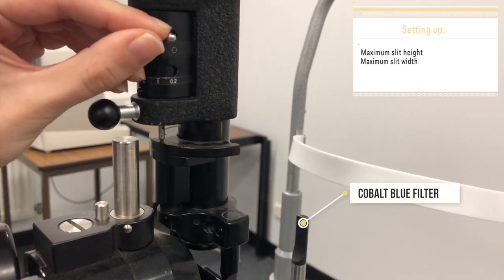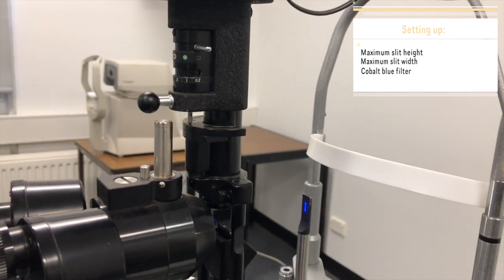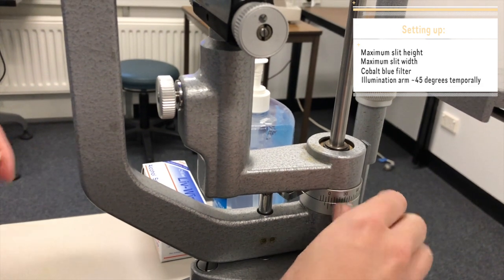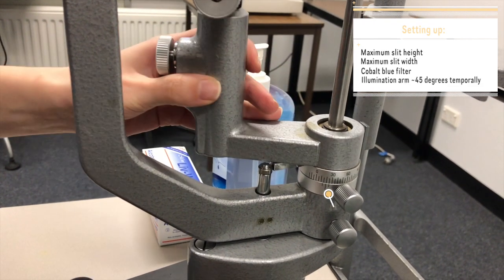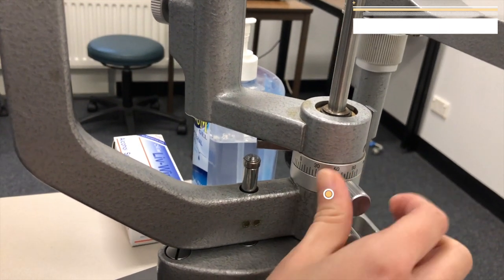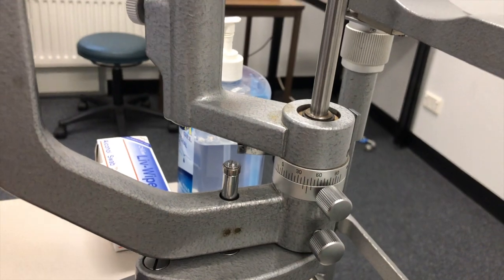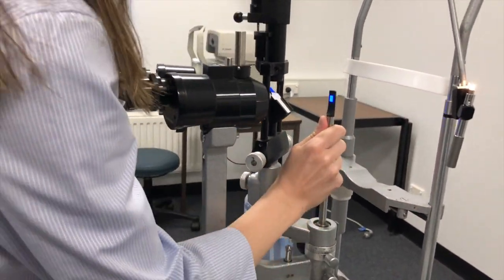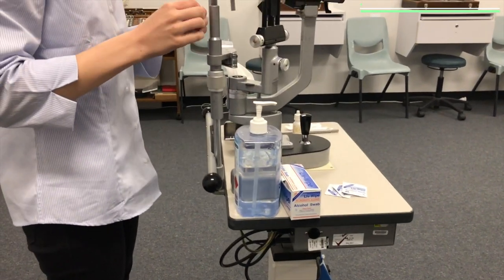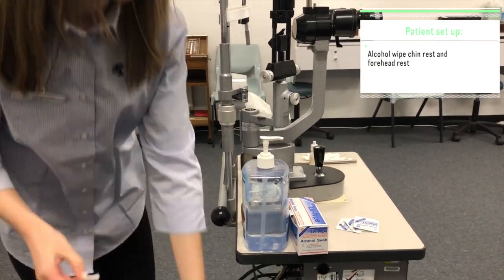The filter is changed to cobalt blue. The illumination arm is then unlocked and moved 45 degrees to the temporal side of the eye being tested. To ensure appropriate hygiene practice, the examiner must wipe the chin rest and forehead rest as well as the joystick.